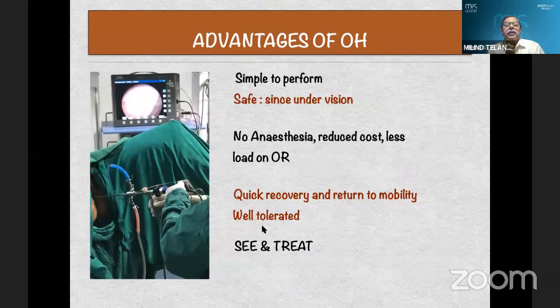And then coming to the advantages. Well, it is very simple to perform if you master the art of vaginoscopy. It is under vision. So no chance of perforation, mind you. No chances of false passages. No anesthesia required, reduced cost, less load on the OR. Now, this is really important for you. Remember, when you say economics, you don't lose money. This money is directly in your pocket.